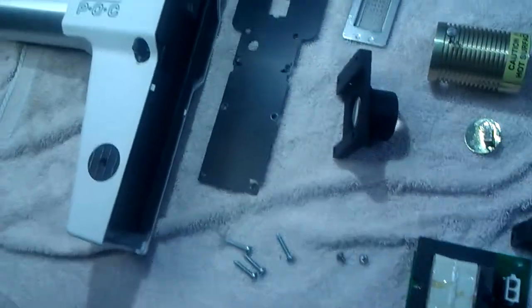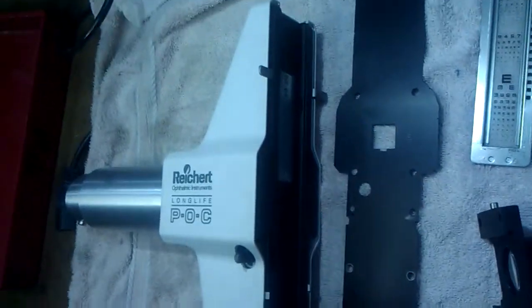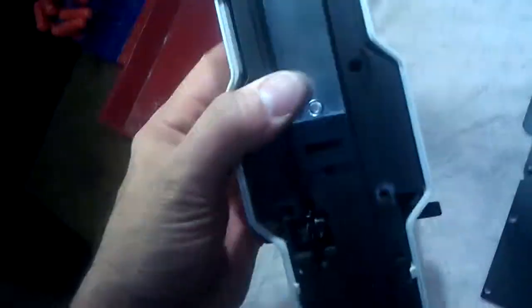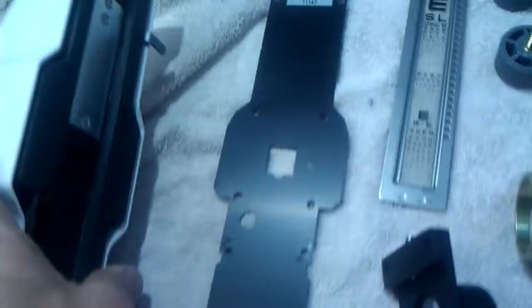I'm taking it apart to service it because it's either gotten dropped or badly crushed. The slide mechanism in here was all bent on this one side. And this rotary here that controls the acuity slide up and down is not functioning properly.